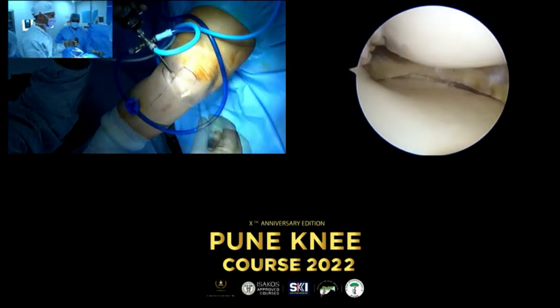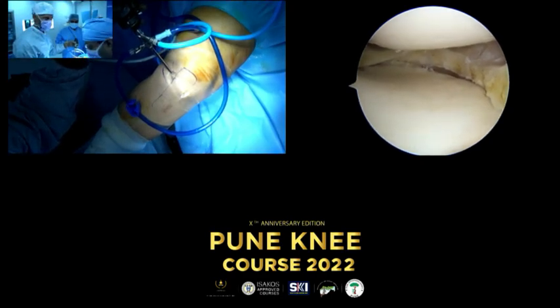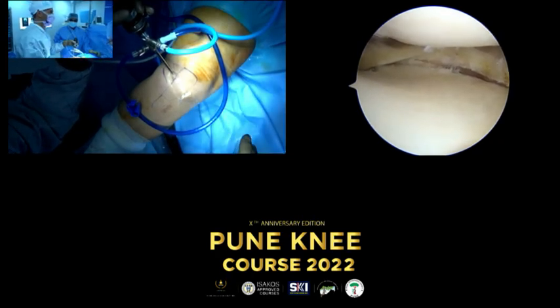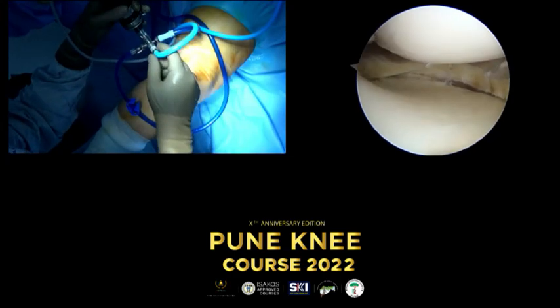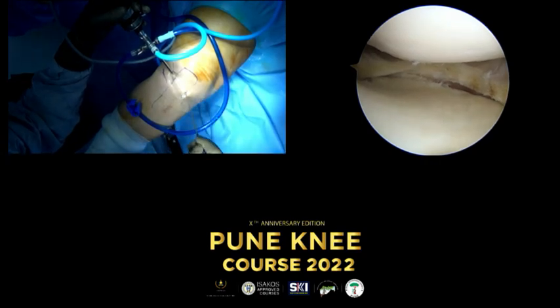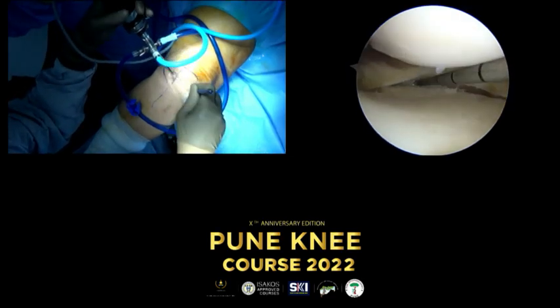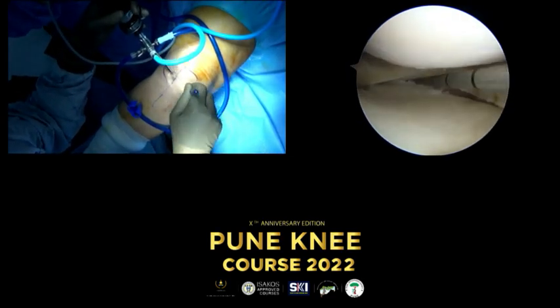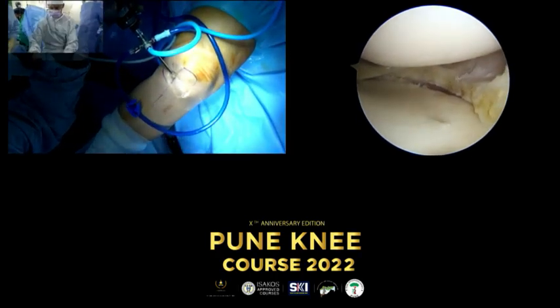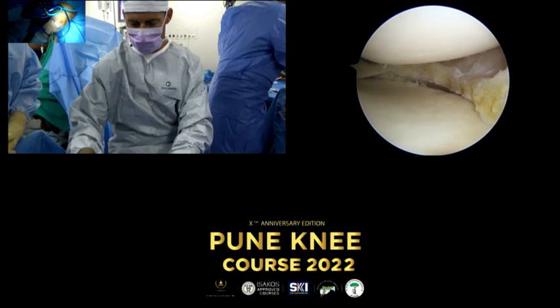And the type of allograft, Pablo, what type do you use back home, and what type are you using here? The same thing. This came with the bone, as you saw before, I just took it out from the medial plateau. I use fresh frozen. I think this is fresh frozen too, right? Yes, the one we have is from MTF. The one we've been used to using in India is fresh frozen, which comes with a tibial hemiplateau. Okay, I will go for the same incision he had because of the ACL.